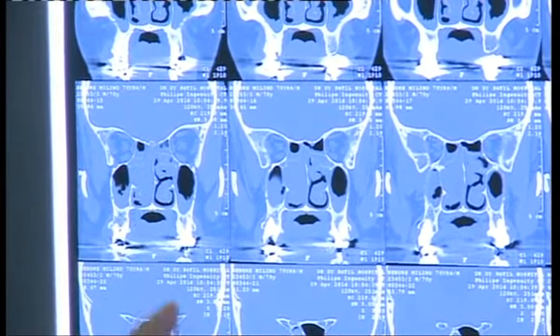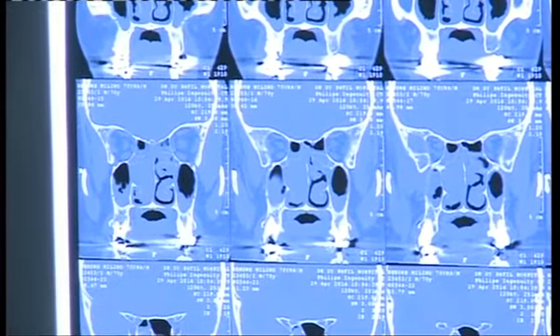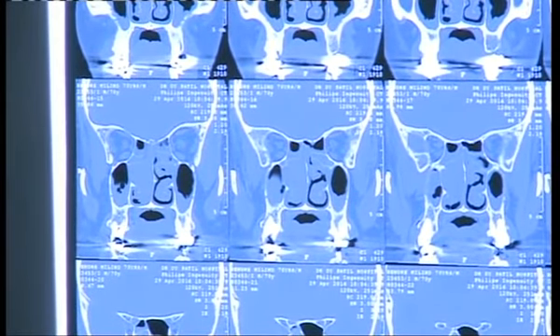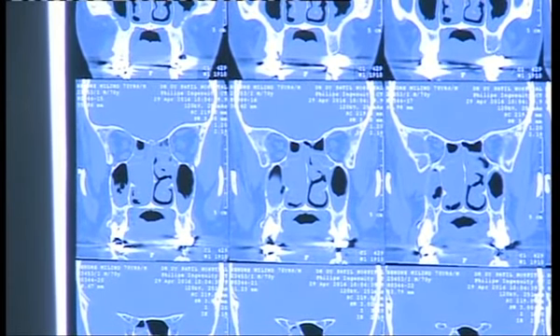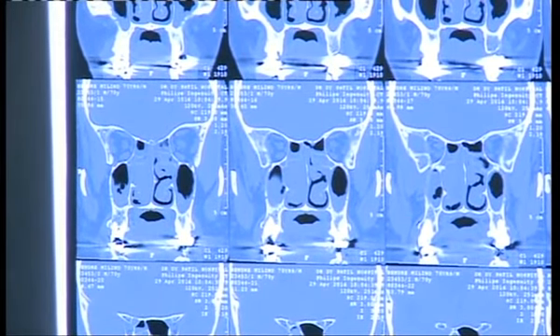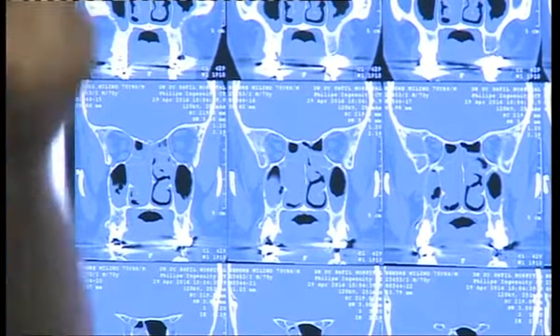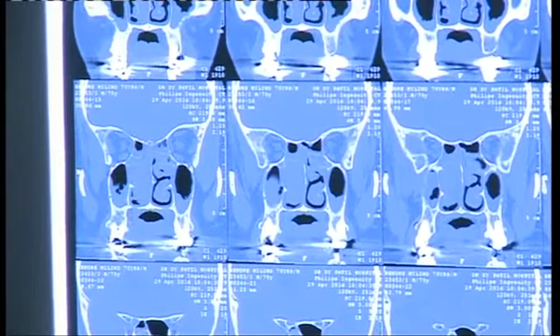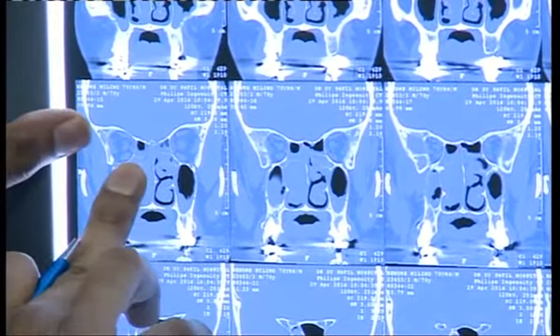This is another, like you asked, the clinical relevance. The moment you enter the posterior ethmoid, they are bound medially by the superior turbinate, all the way from anterior to posterior till the sphenoid. That's the medial boundary of the posterior ethmoid. So again, the posterior ethmoid is like a box. I am going to show during surgery how it is related and what is the importance.